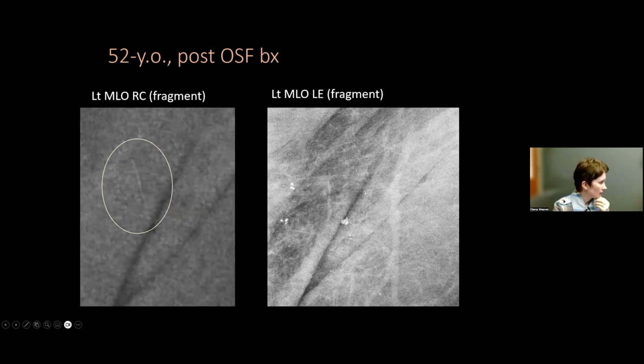So this turned out to be a splash artifact, but it wasn't really on the working surface of the paddle or of the plate, because we wiped it multiple times. We actually saw it on all four corners on multiple images, so multiple projections. So be careful, it can be inside of the paddle. Sometimes you just need to reach out to the vendor if you see that persistently.